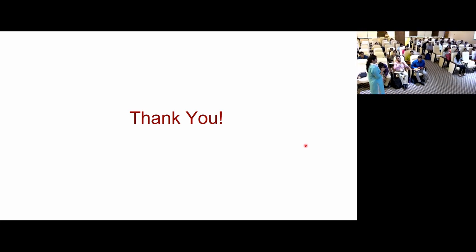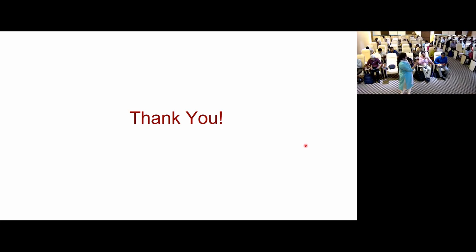Hello. As far as the proficiency testing is concerned, we are doing it with your lab. For DNA-seq, RNA-seq and RQ, it is very sorted. But as far as the KDM goes, we do it by Sanger sequencing and you do it by NGS. So that will not work out, no? Because we are not working on the same modality.